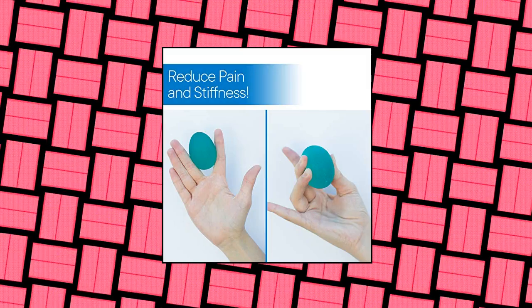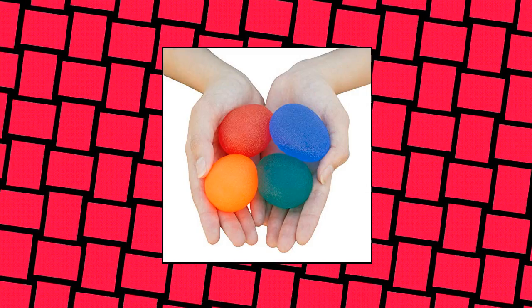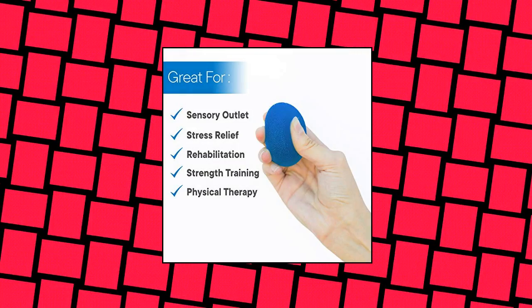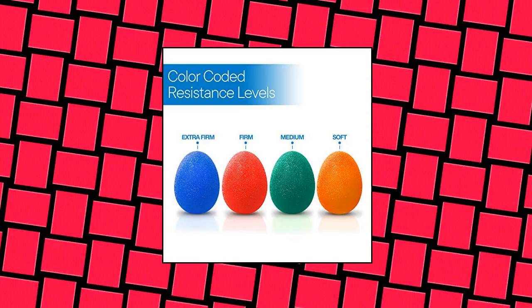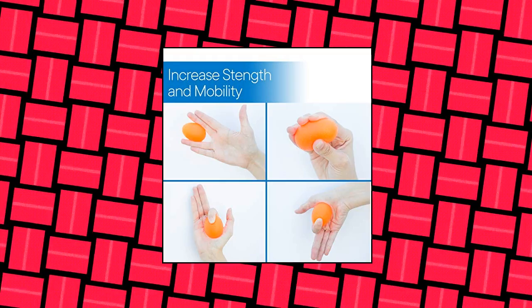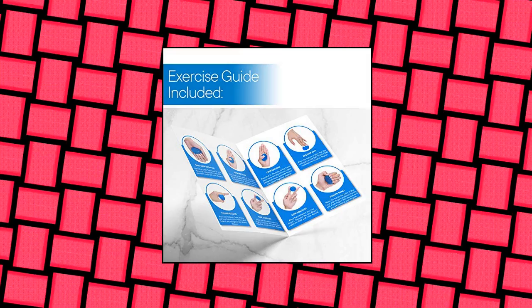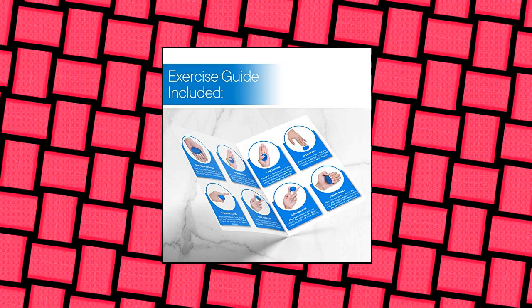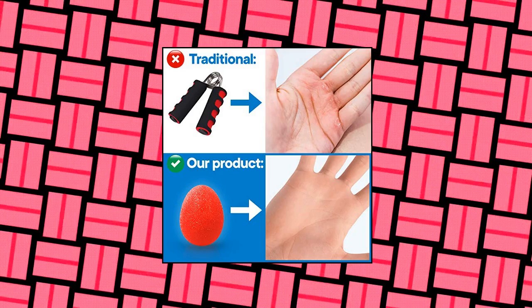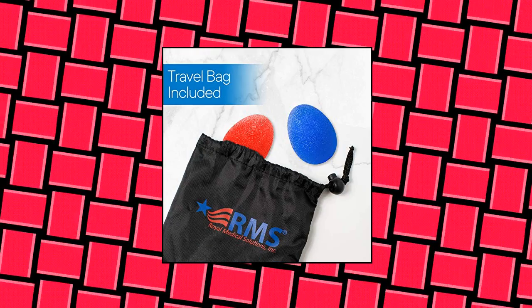RMS 4-Pack Hand Exercise Balls — physical occupational therapy kit for strengthening grip, reducing stiffness, arthritis pain relief, and rehabilitation. The unique egg-shaped therapy balls fit well in the palm of your hand. They are made of soft, easy-to-clean thermoplastic rubber. Unlike other hand exercisers, they are lightweight, hypoallergenic and reusable. Therapy balls come in four resistance levels, allowing you to slowly increase your hand strength over time. Each resistance level is color-coded.